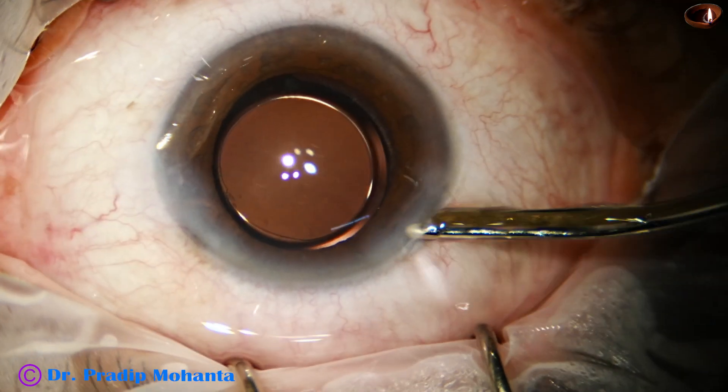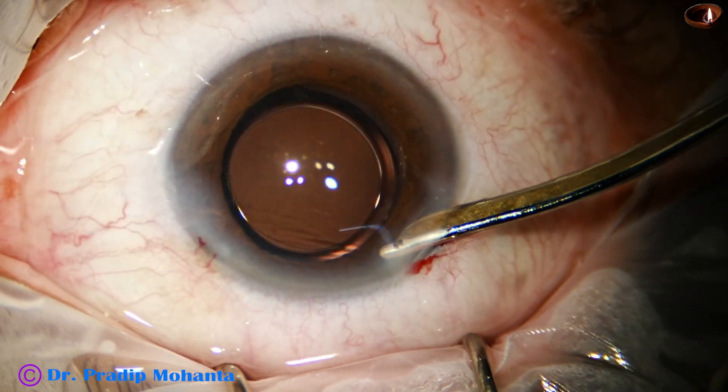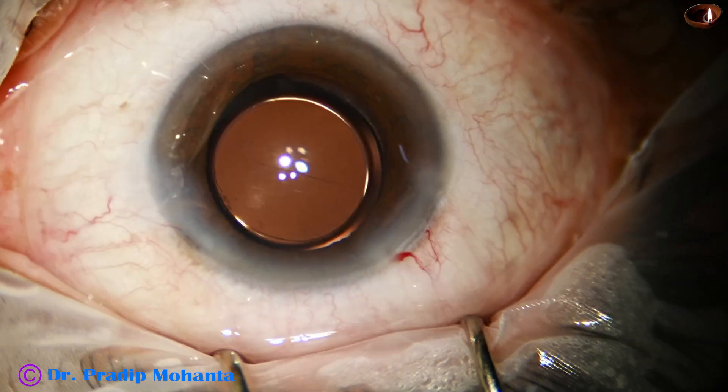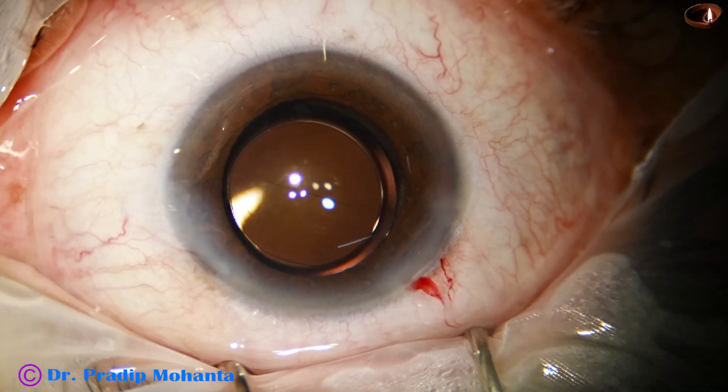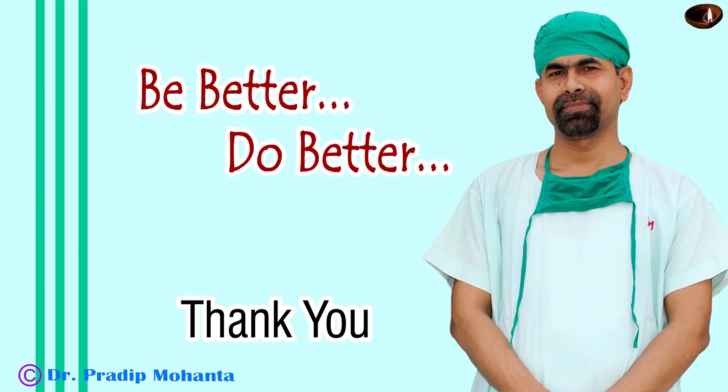The anterior chamber is nicely formed. After forming the anterior chamber with the Simcoe cannula, integrity of the wounds is checked and the case is concluded. Thank you very much for your attention. I hope this video will help you in developing your surgical skills and encourage you to use Mohanta's pre-chopper in your surgeries.